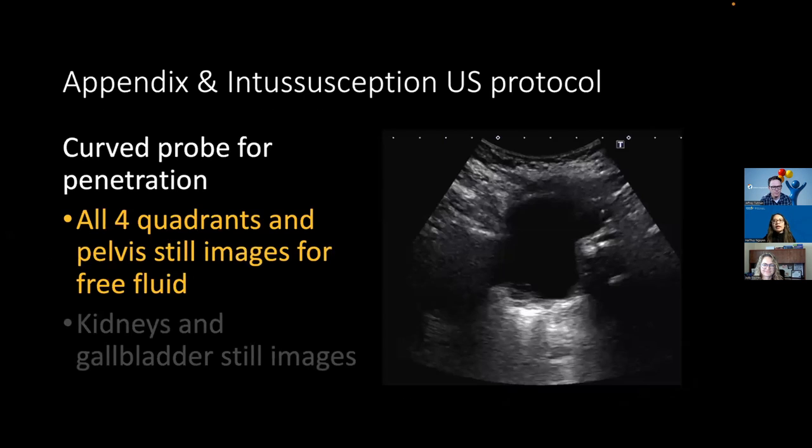All right, so now to go through our protocol. Essentially here at CHLA, we do appendix and intussusception sort of into one, because on the intussusception, we look for the appendix, and then vice versa, on the appendix, we try to look for the intussusception too, if they're at the appropriate age.